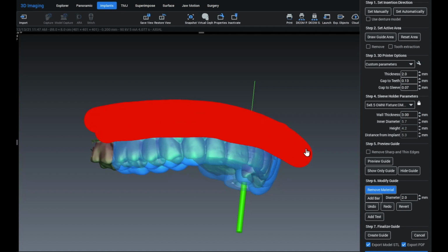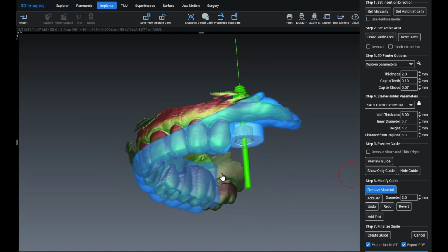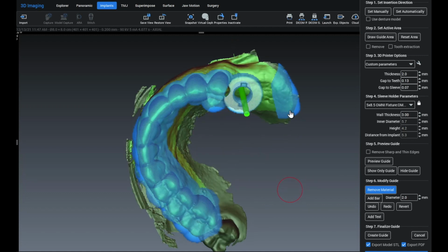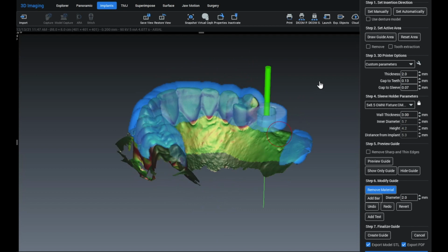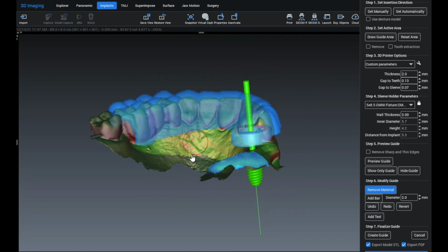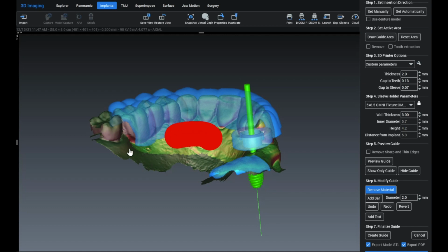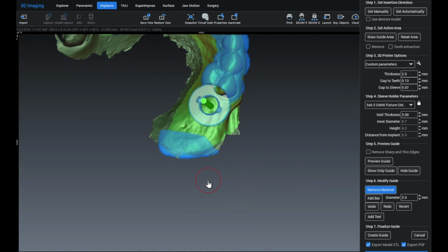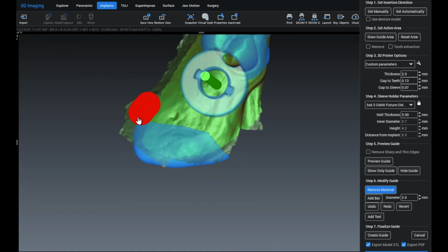So in this case, you want to leave all of that posterior surface area beyond the area where the guide is. So you can see that we're erasing. I like to erase directly under the sleeve holder and then leave some of that surface area covered by the surgical guide. So again, just trimming the flanges here beyond the undercuts, apical to the undercuts. We don't necessarily need it to extend so far posterior on the contralateral side.